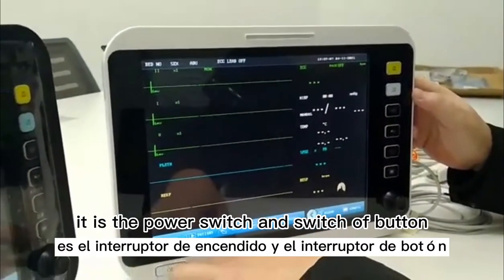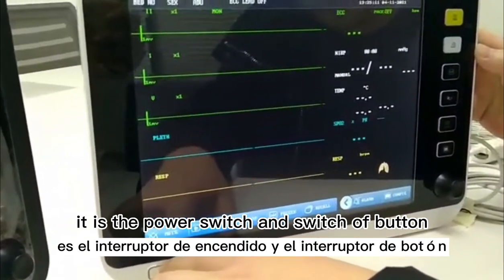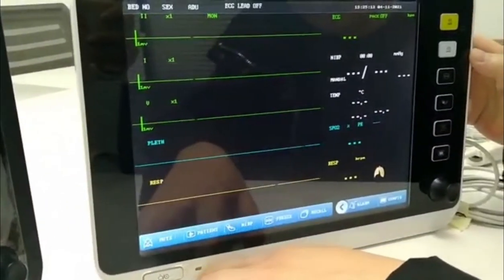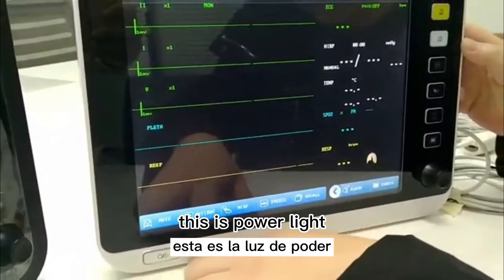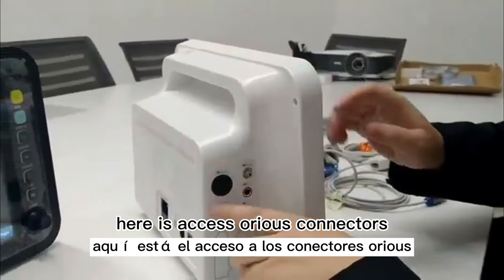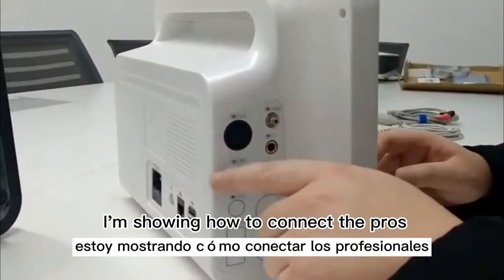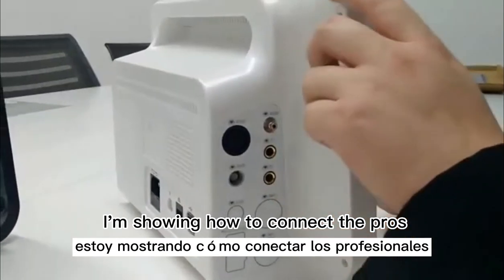Here is the power switch on and switch off button. This is the power light. Here are the accessories connectors. Now I am showing how to connect the probes and accessories.